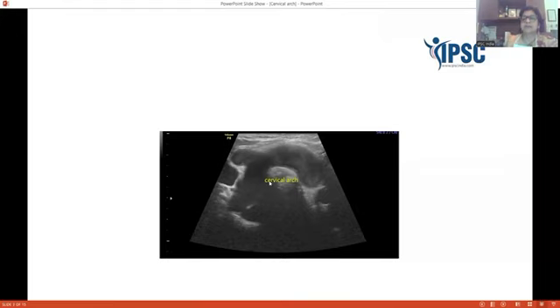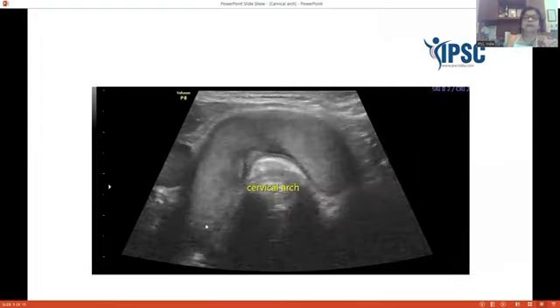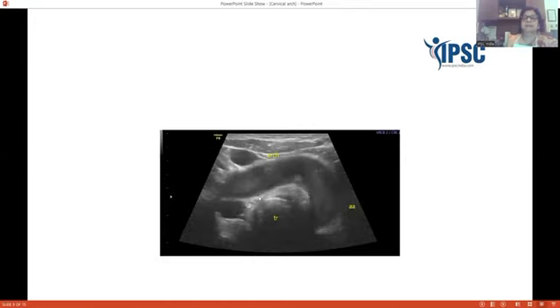And the first thing which came to my mind was, is it a vascular channel? An abnormal vascular channel. The moment I put in color, it showed high velocity flows. On magnifying, I could see the gush of blood in this and also multiple tortuous channels coming out from it. On tracing it further, I could see that this channel was tortuous and arising from the ascending aorta, continuing as the arch, and there was a possibility that it was a right-sided arch.